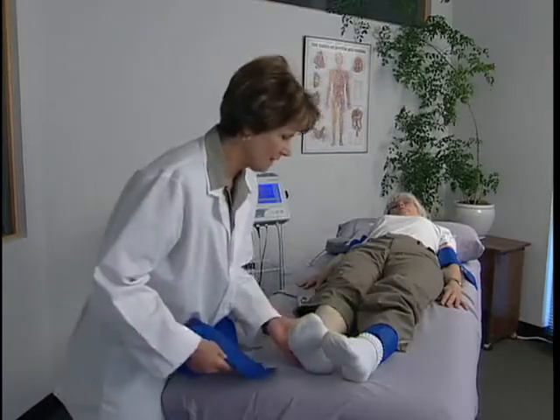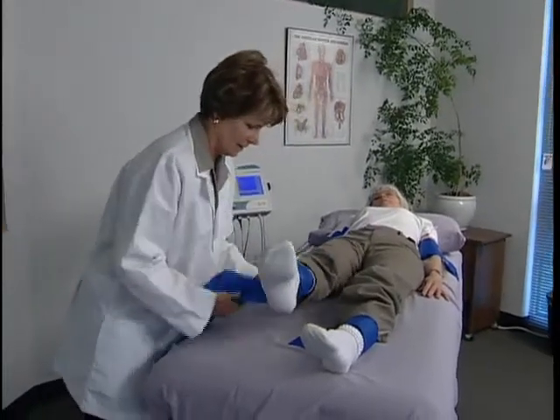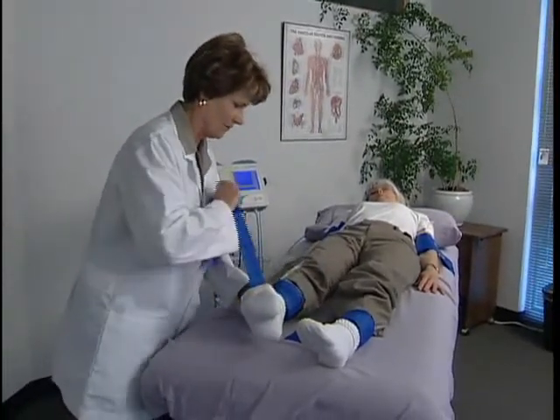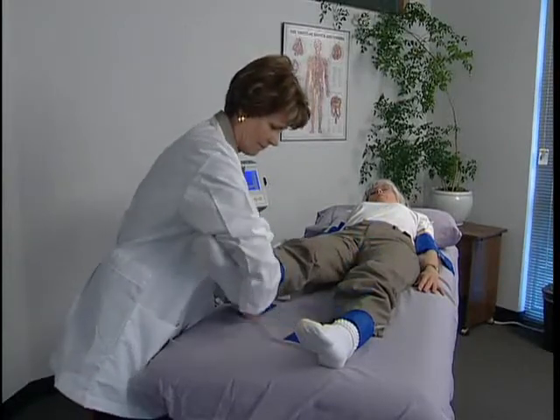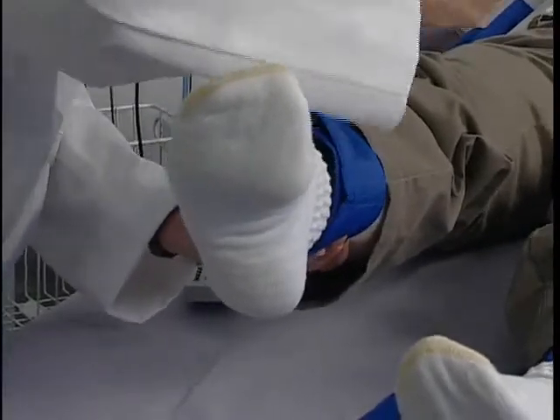Wrap a cuff at each site to prepare for the exam. It is important that the patient lay still and the toes are reasonably warm. It may be helpful for the patient to keep their socks on while preparing and take them off just before applying the PPG on the toe.